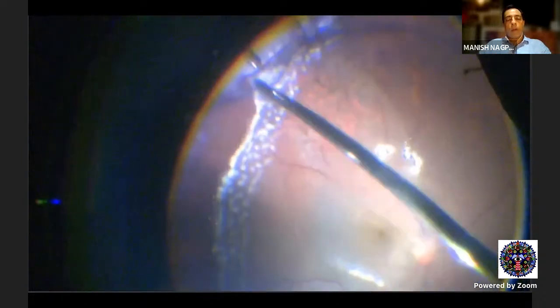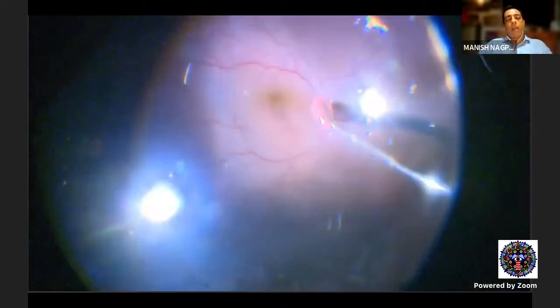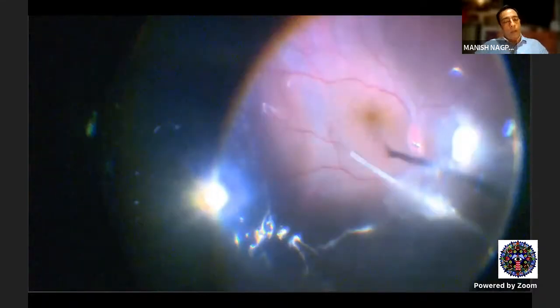So the same steps, except here, as you can see, I'm removing the extremely peripheral vitreous and the peripheral edge of the remnant of that. And then once you do the exchange, this is what I was talking about: keep all the edges dry, and you can do it only if you are viewing it well, and that's where the wide field systems come in, because if you cannot see that area, you cannot keep it dry, and you cannot watch it.